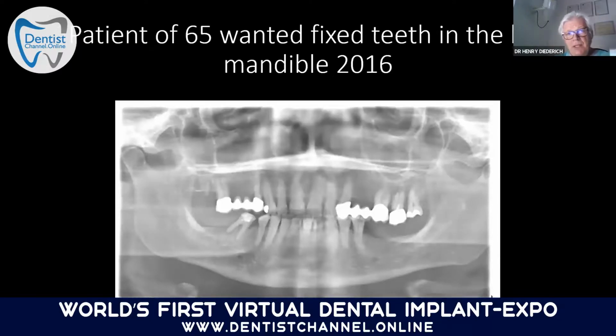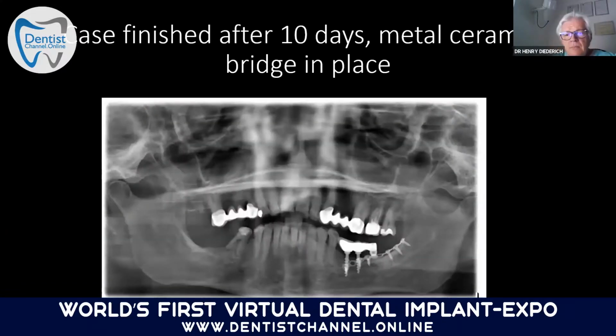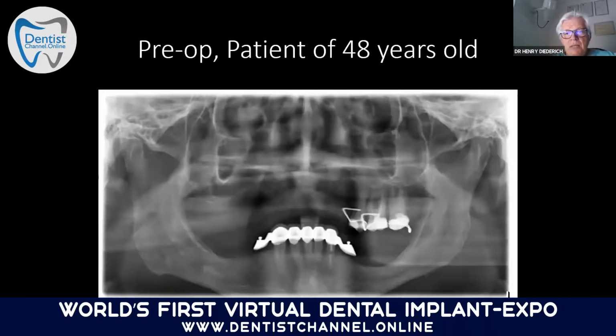This lady, she wanted fixed teeth in the left mandible. Also here it was critical because there was not a lot of bone height. We did cemented and screw retained. Cemented because we used here 1-piece implants in the front in position 35-36, and then the plate. And 10 days later, we could put our bridge, and it was done.